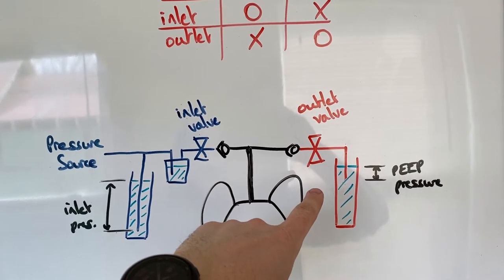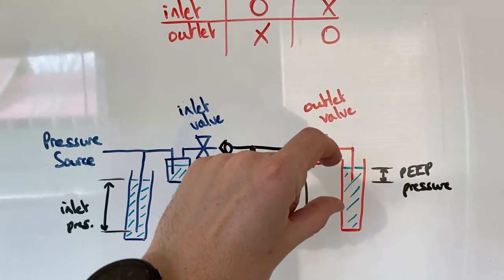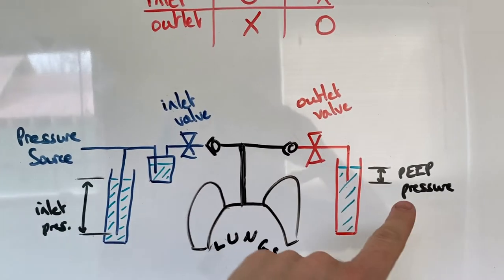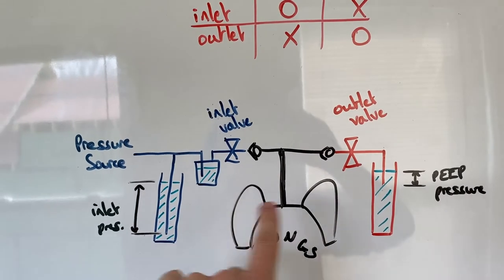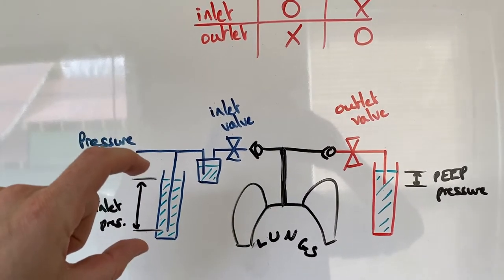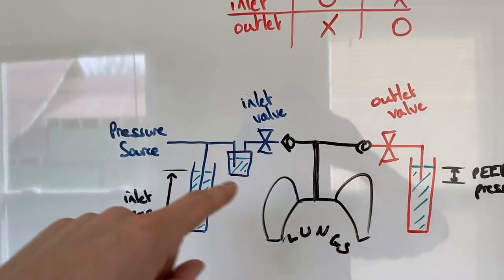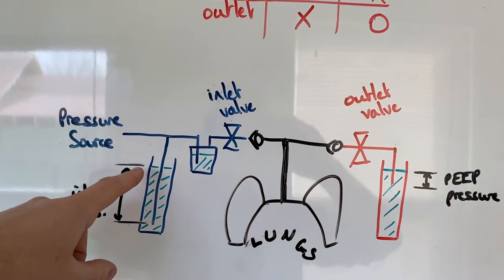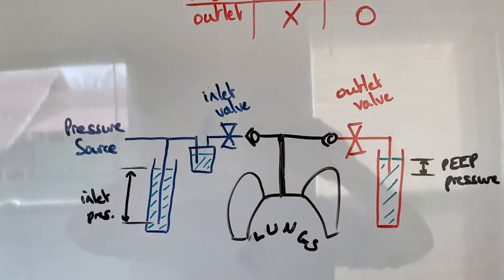The PEEP pressure regulator means the pressure inside the lungs will never go lower than that head of water — you can set it to whatever you want. The inlet pressure should be around 35 centimeters of water, but you might want it up to 70. The PEEP regulator should be about 5 centimeters. It's very important that all three of these are kept sterile so you're not pumping disease into somebody's lungs. It's also important that these heights are fixed. All of these components, apart from the valves, can be made with plastic bottles and tubing — garden hose works just as well as medical tubing.